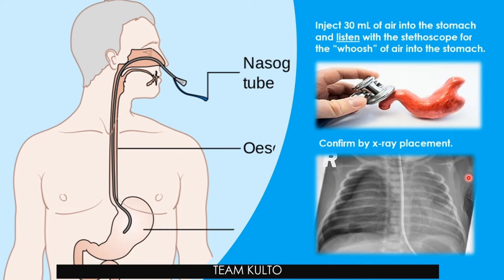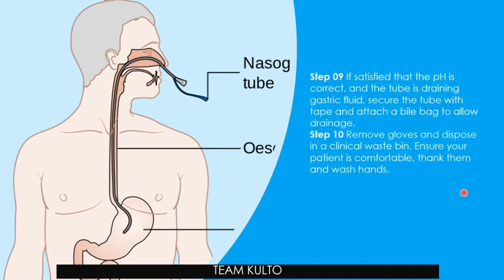Well, ang pinaka-confirmatory naman kasi natin talaga is yung X-ray. Now, the X-ray visualization is the only method that is considered positive. Makikita mo ito siya. Yes, normal yan. Normal yan. Pag nakita mo na itong tube na to napunta dito, ay di mo na sa pool yung kanyang tummy. Tummy! Napunta ka sa baga. Ganyan. Next. Step number 9.